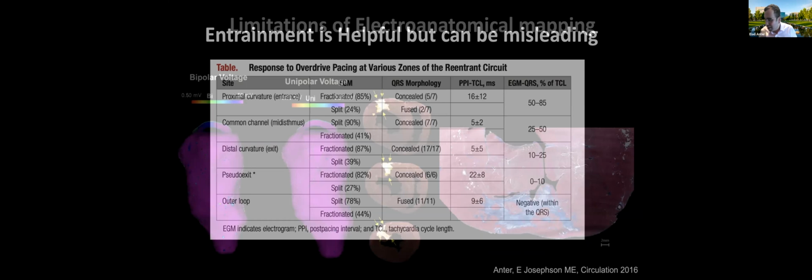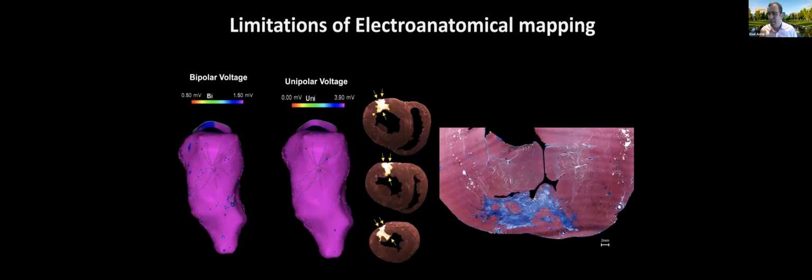Lastly, and that's transitioning to Saman's talk soon, I'm not that enthusiastic about electroanatomical mapping in general, or about the future of them for mapping therapy for arrhythmia, because what we really see is the surface. We are able to see 1 or 2 millimeters from the surface.